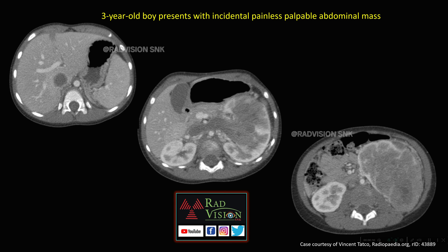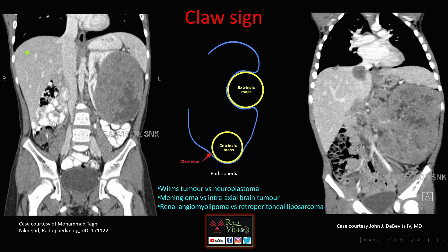This is a classical case of nephroblastoma. You can see the claw sign in coronal sections — a mass arising from the kidney with sharp angles between the mass and the kidney. Whenever there is a mass originating from an organ with sharp angles adjacent to it, the mass is probably arising from that organ. If there are no sharp angles, it is an extrinsic mass abutting or displacing the organ. Claw sign helps in differentiating nephroblastoma from neuroblastoma, meningioma versus intraxial brain tumor, and renal angiomyolipoma versus retroperitoneal liposarcoma.